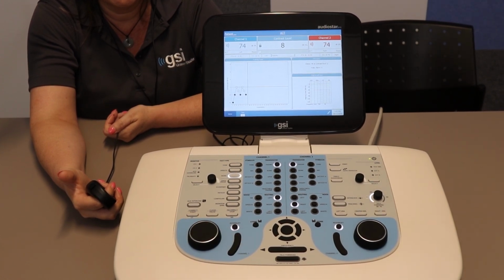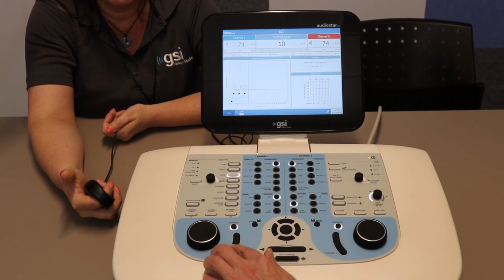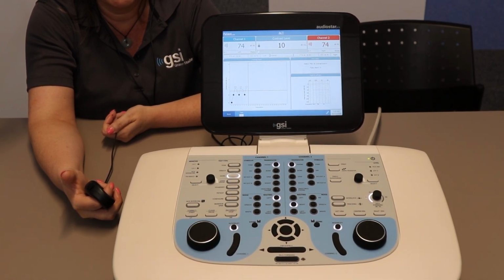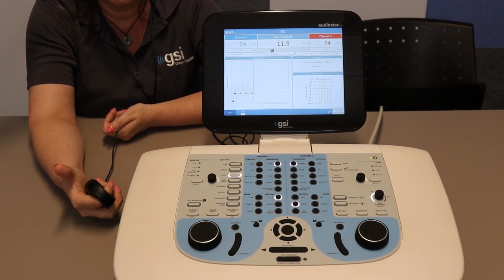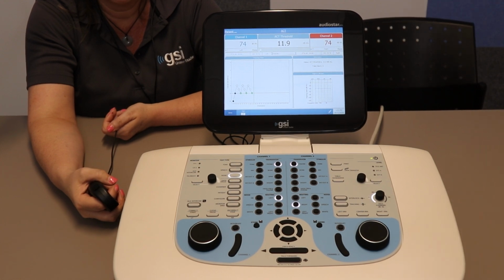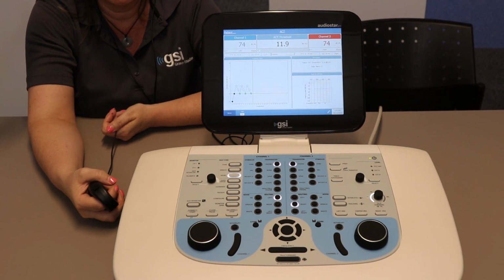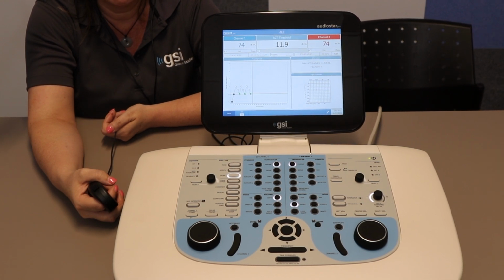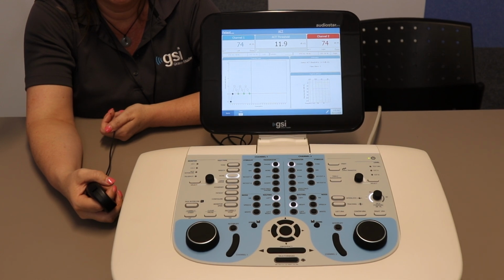I continue my bracketing. It's a lot like gaining a threshold in air conduction. So no response there at 8. Going to move it to 10, and then to 12. And now we've got our ACT threshold established. What we're looking for is 3 consistent responses at what we call 3 out of 5 turning points, where you're trying to gain threshold and moving up and down in that contrast level. The test automatically stops once it is complete. So you can see those 3 green check marks there indicating that the test is complete.